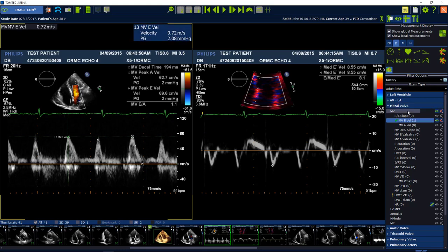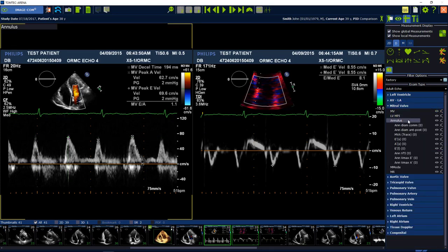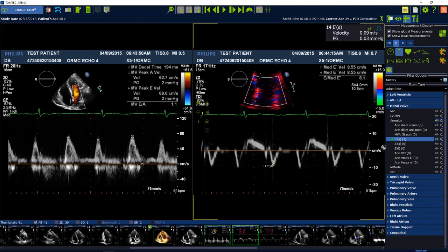Close the sub-item MV and choose annulus. Select the E prime septal measurement, move into the image and perform the measurement with a left mouse click.